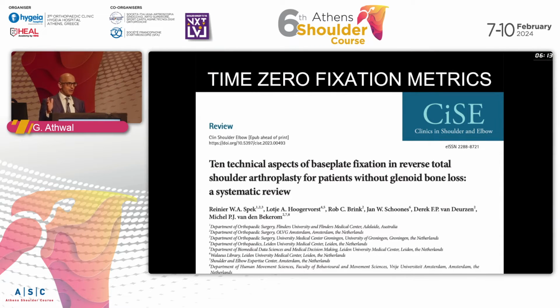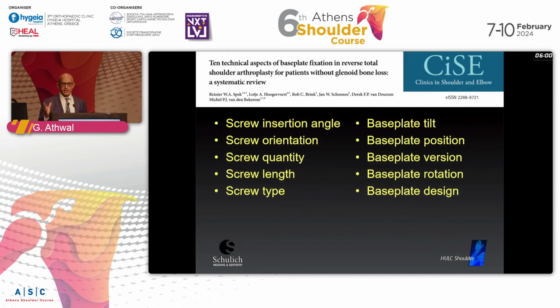I recommend anybody who's interested in this read this, because it reviews all the literature on 10 technical aspects of reverse base plates and screws. And I'm going to kind of paraphrase this for you here. So these are the 10 factors this paper looks at. It looks at all the evidence, and that's where you start to realize that there's really good biomechanical evidence, but our clinical evidence is lacking.